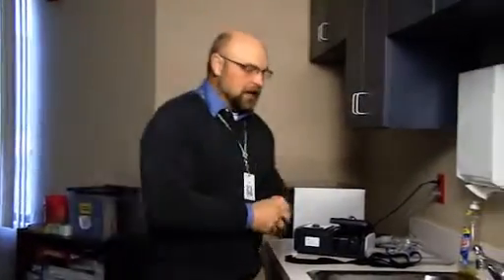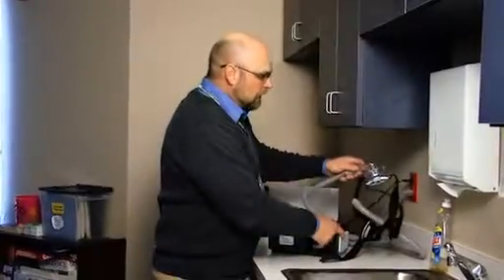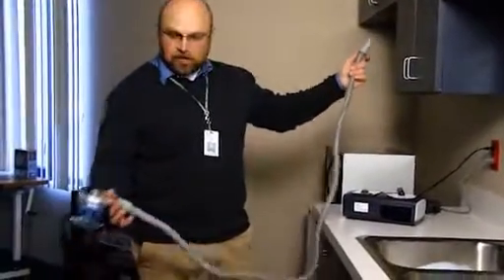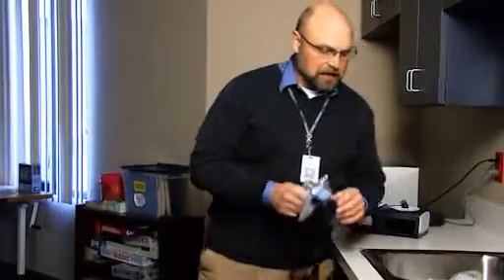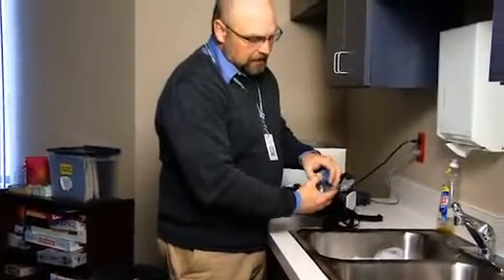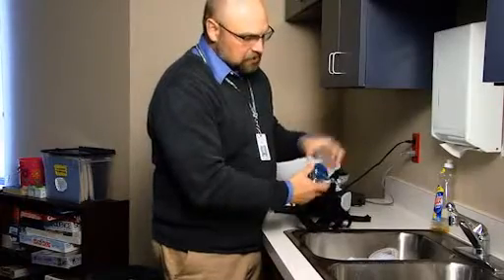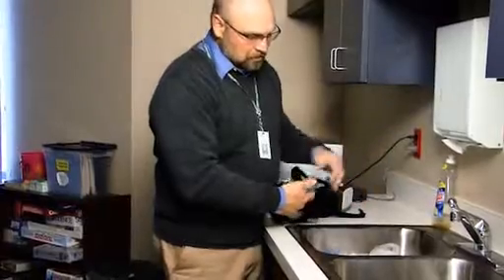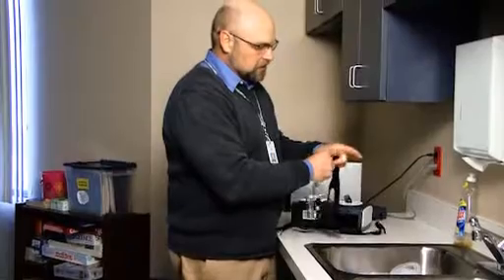So you want to wash it, and while that's soaking, on a weekly basis I disconnect the circuit, whatever circuit that you have, the long 6-foot hose. You want to just take that off and submerge that in the soapy water also. Plus with the mask, you want to disassemble the mask, and the trick to disassembling it is just pulling it apart from the flap and cushion and putting that in the soap. Put this also in the soap.